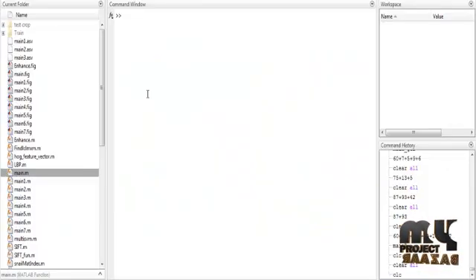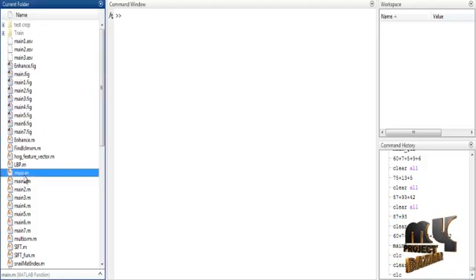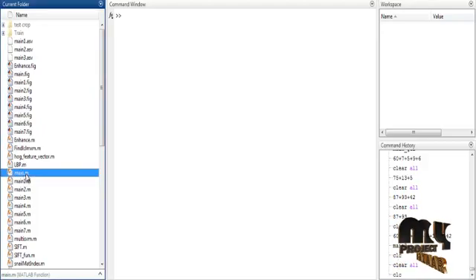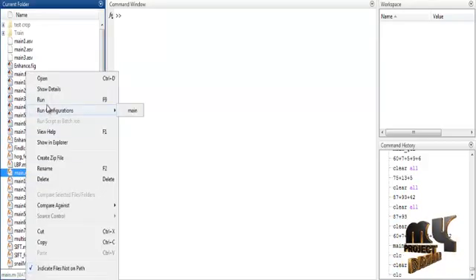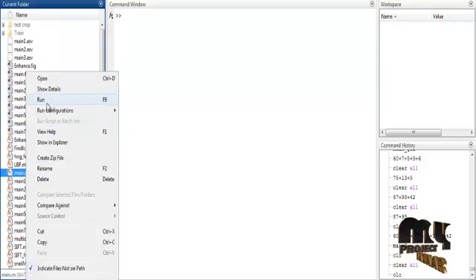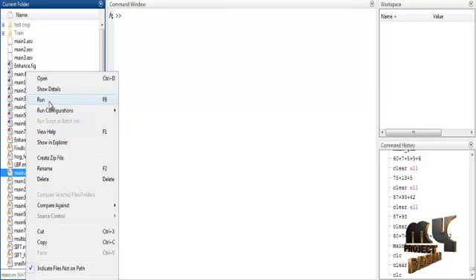Now we discuss the initial running procedure. Select the main.m file, right-click on that file, and then select the option Run.